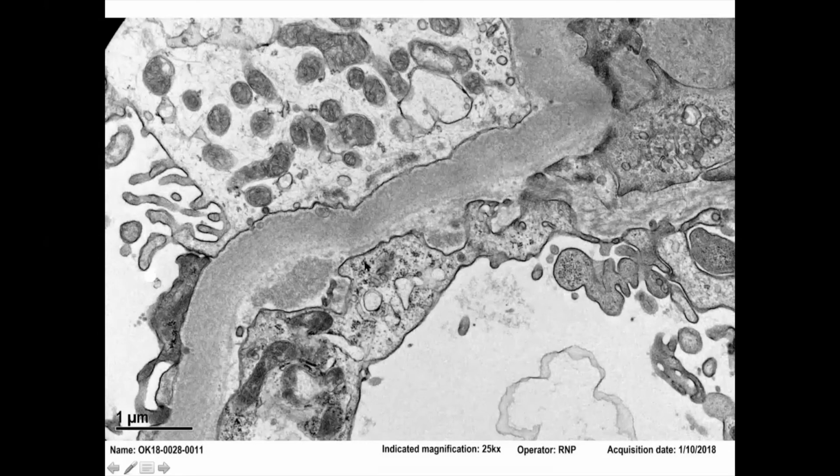And remember the speckled pattern inside the endothelial cell? This is what we call tubulo-reticular inclusions, TRIs, and these are not essentially pathognomonic of lupus nephritis, but they are supportive of the diagnosis. We can see them in other diseases as well. But their presence along with positive serologies and mesangial deposits, and seeing them in the endothelial cells, the TRIs, is supportive of a diagnosis of lupus nephritis.